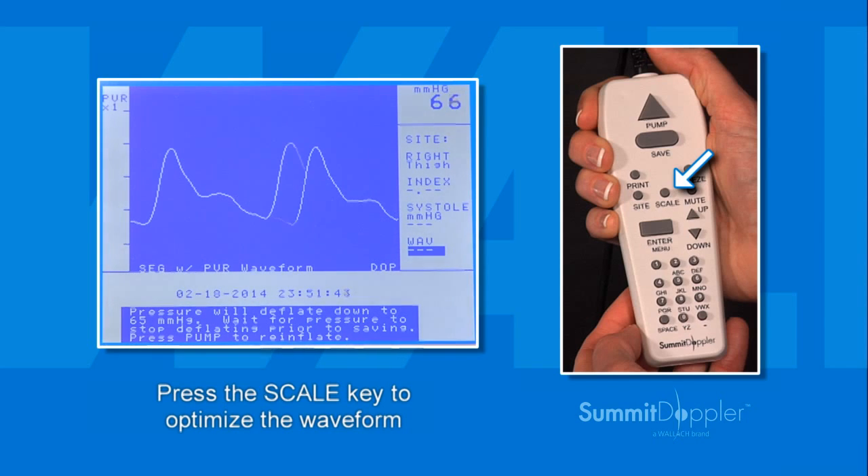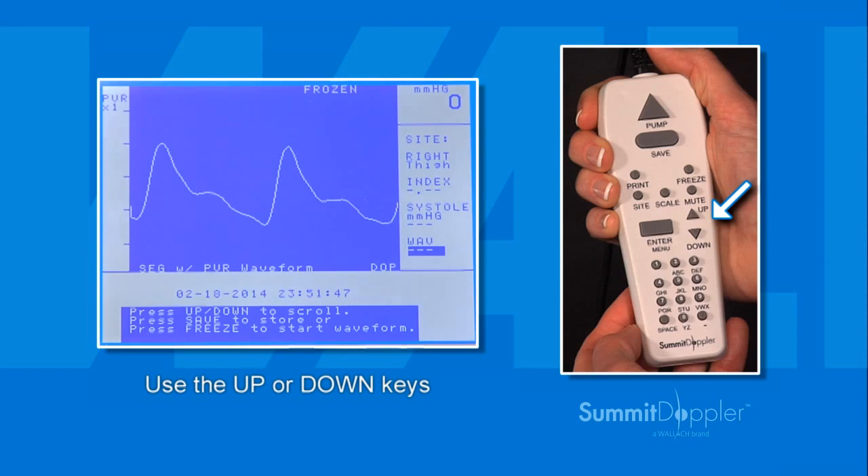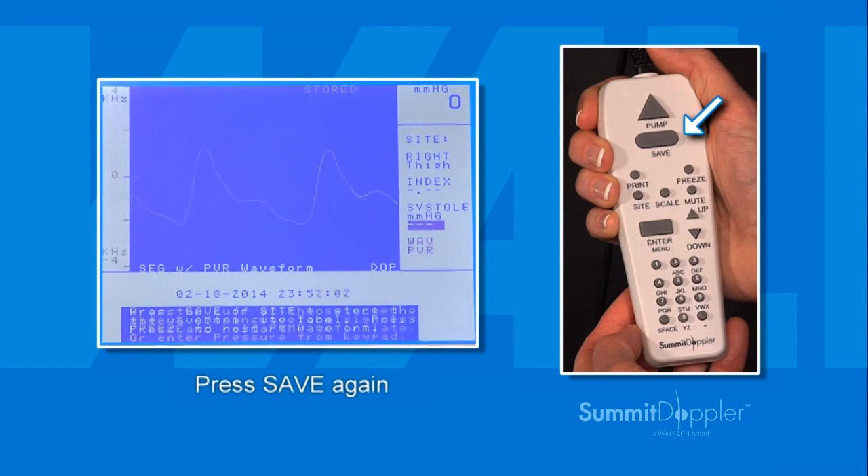Once the waveform is optimized, wait for it to stabilize and become consistent and press the freeze key. Adjust using the arrow keys as needed. When completed, press the save key and then press save again to move on.